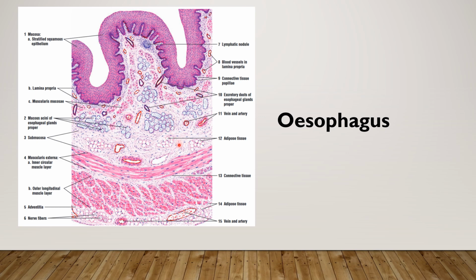submucosa. So this is our submucosa. Up to this it is mucosa. Now this part is the submucosa. As I told already, it is made up of moderately dense connective tissue with elastic fibers, collagen fibers, blood vessels. You will be having blood vessels and nerve plexus also.